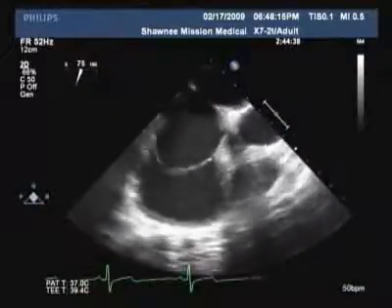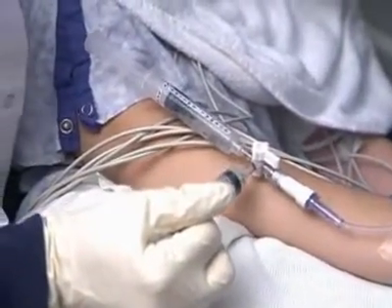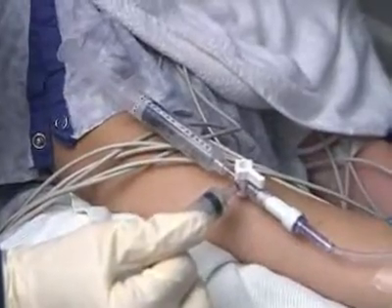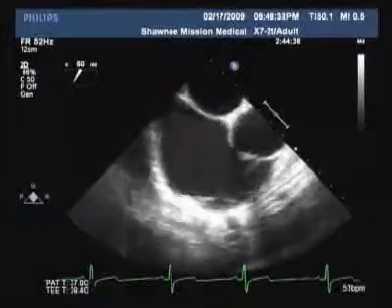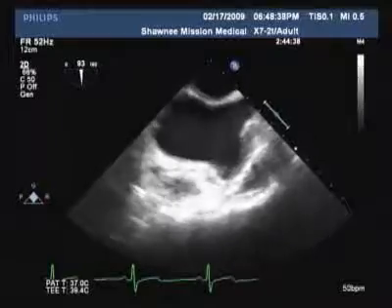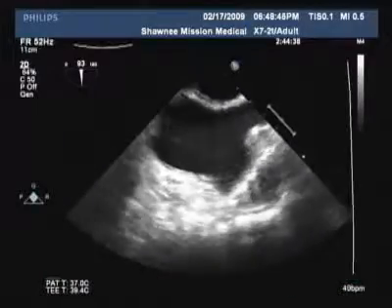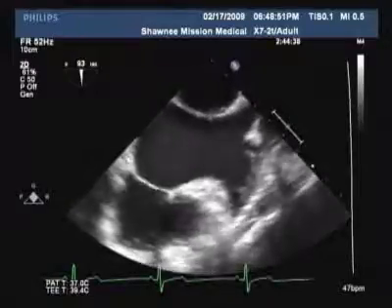And what he's doing, this is just salt water or saline, which we use in the hospital all the time, and you just shake it up. It's not a lot of extra bubbles thrown in there. It's just bubbles that are already dissolved, their oxygen already dissolved in the saline, which is normal. Shake it up, and then these little micro bubbles, which you can't even see with the bare eye, but with the sonogram, the sound waves bounce off these little bubbles, and you're going to be seeing sort of like a snowstorm of little bubbles. These are not bubbles that are big enough to see, but they show up very well with sonography because the sound waves bounce off of them.